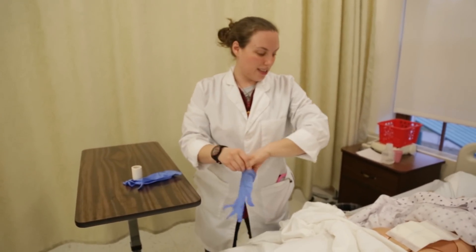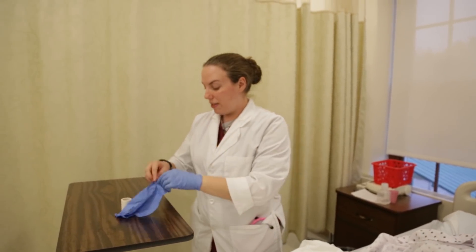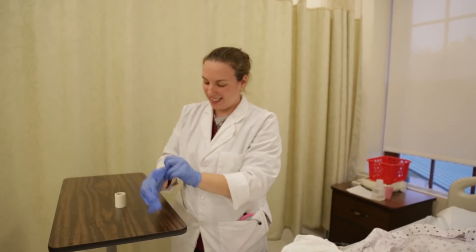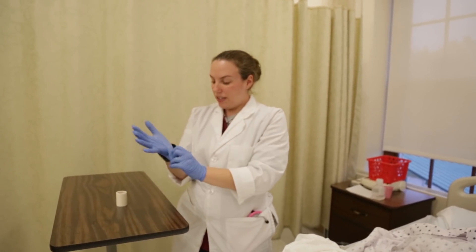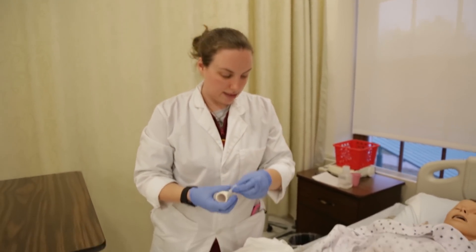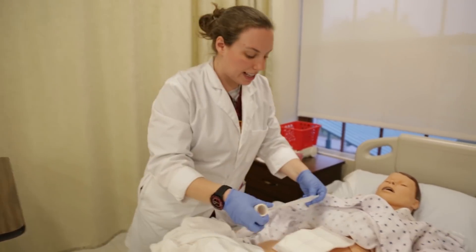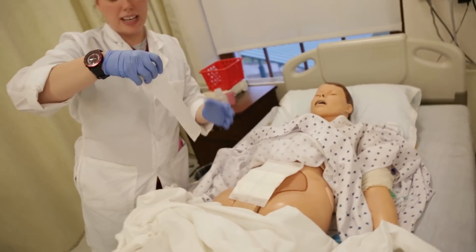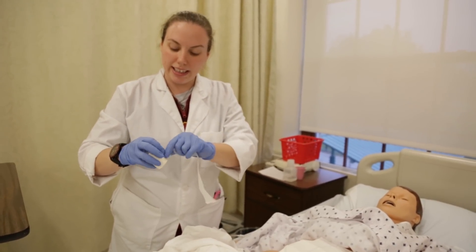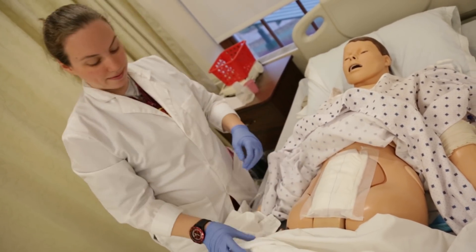We turn to clean because we need to tape it down so if the patient moves, the wound packing won't come loose. We put on clean gloves and tape the wound. I try to measure out the tape because too much tape might cause pain when taking it off. I ask the patient if there was any pain throughout the entire process — the patient states no, which is good.